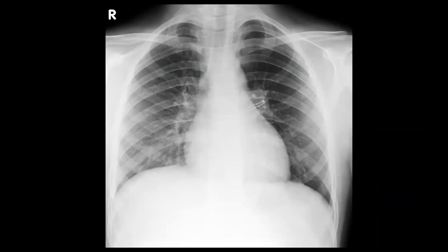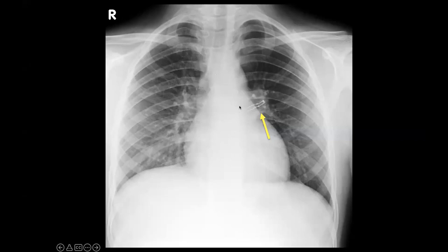This patient with a persistent cough had the opposite effect — it's easy to see the radiopaque foreign body, a hair clip protruding into the upper lobe bronchus. But the first thing you should do is go: the left lung is more lucent than the right, and I can't account for it by rotation because the patient isn't rotated. So look at the airways and follow the trachea down. If there was no other cause — no lymphadenopathy, visible mass, or vascular ring — you must consider an ingested radiolucent or radiopaque foreign body.